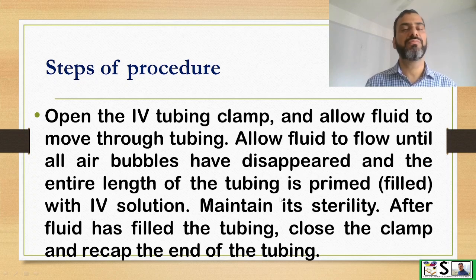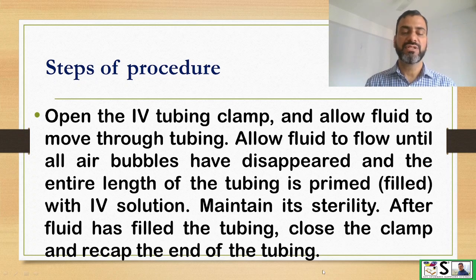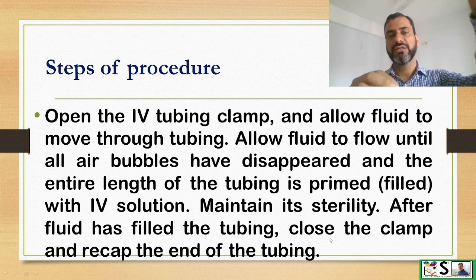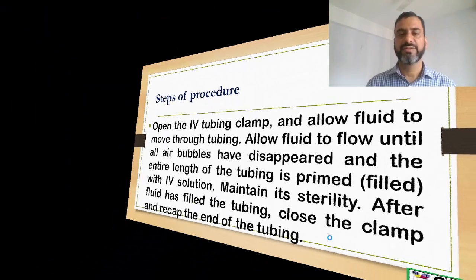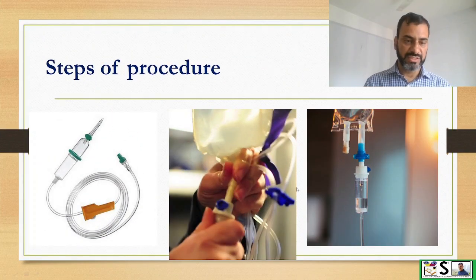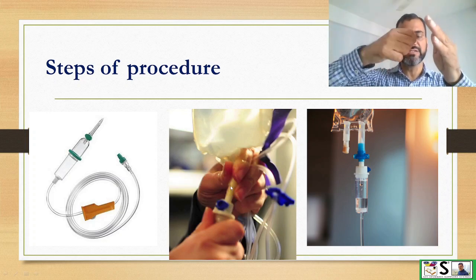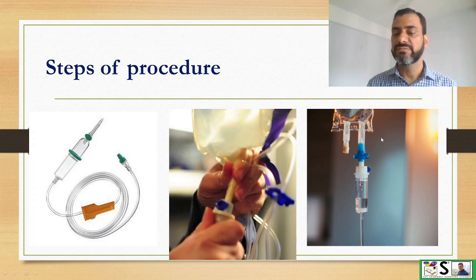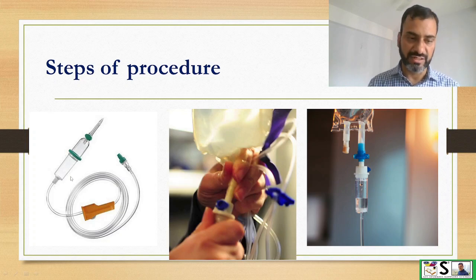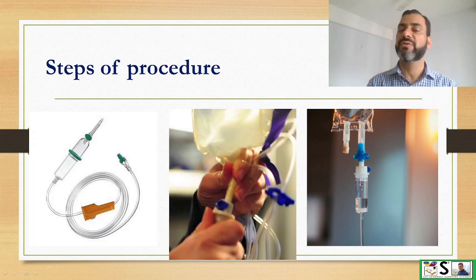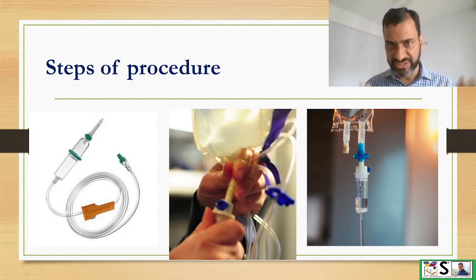During this procedure we should maintain sterility, especially at the endings of the tubings. After the fluid is filled in the tube, close the clamp, recap the end of the tube, and hang it on the pole. Insert the spike portion by twisting movement into the bottle, half-fill the chamber, prime the IV drip set, then recap and hang. In this way we have prepared our IV drip set and fluid.